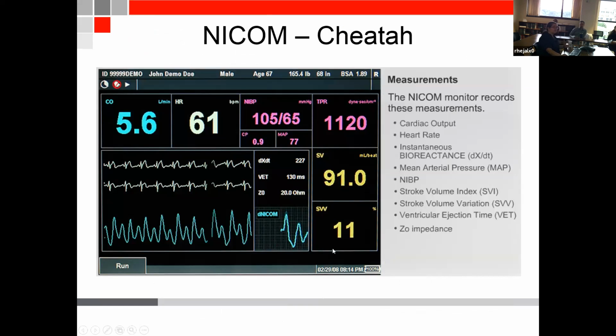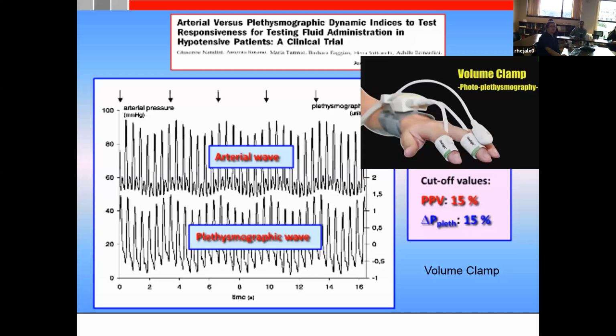And if somebody's on the ventilator, it will actually give you what the variability is. But this one, just ignore it. Just go by this one: lift the legs to a predetermined position and calculate the difference. If that is 10% or above, then you know that this is the case. Now the lifting part is also guided by the machine. There is a little gadget at a 45-degree angle that the nurses will put underneath. You tell it, push the button, I'm starting the test, and it will start recording for you and give you the outcome immediately afterwards.